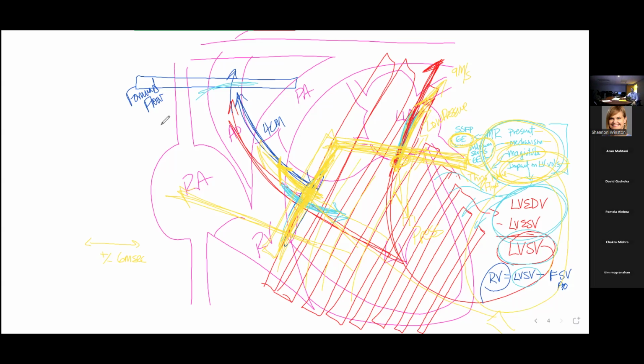Let's see. Can one quantify the amount of flow within plane? Yes, but you've got to have an analysis tool to do that. So you can collect it, but you've got to make sure you've got an analysis tool. And where do we use that? Very frequently. We use that when we're measuring something called pulse wave velocity. So that's this change in velocity. I didn't draw the aorta here. It goes way down here behind. And so we're measuring the velocities along different points and the distance, the change in those velocities over the cardiac cycle, when we do pulse wave velocity.